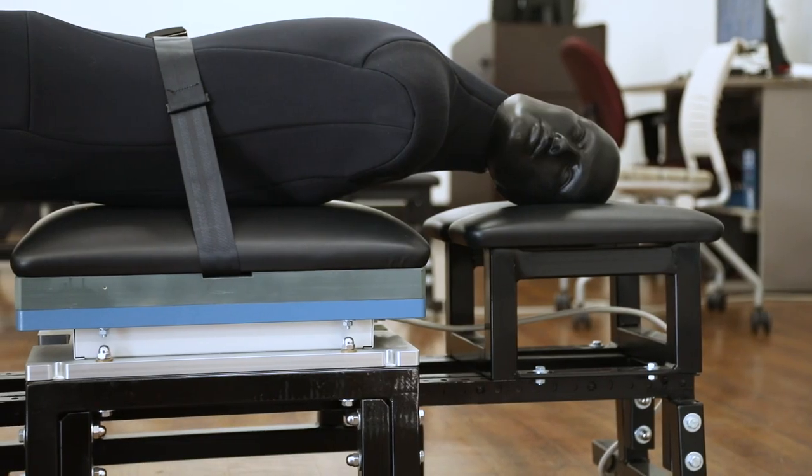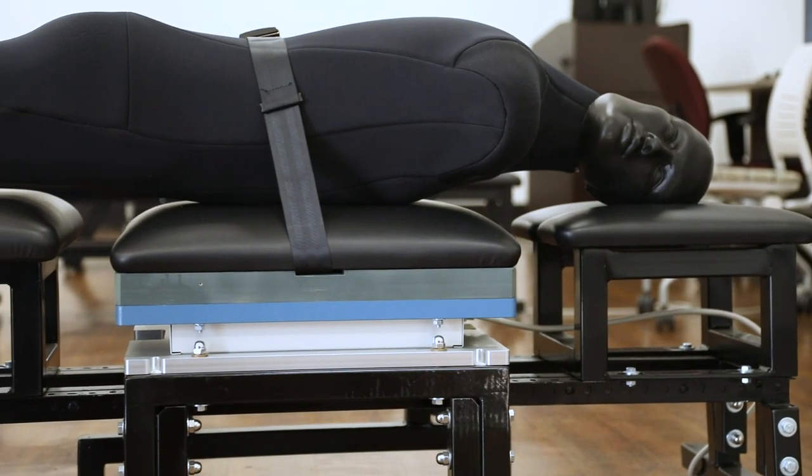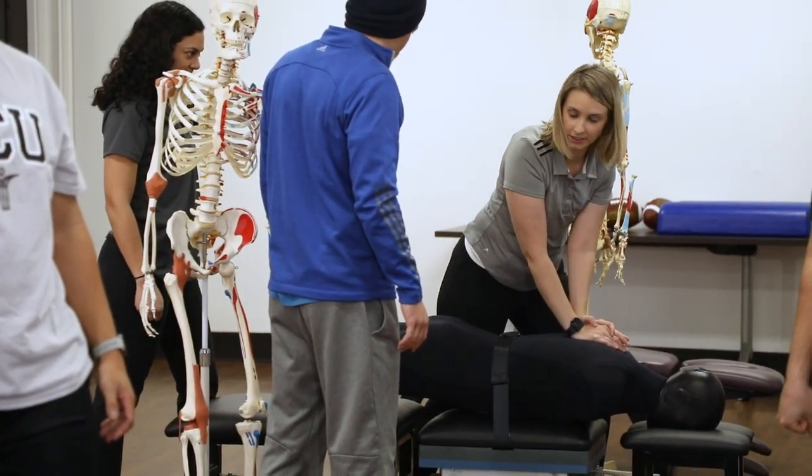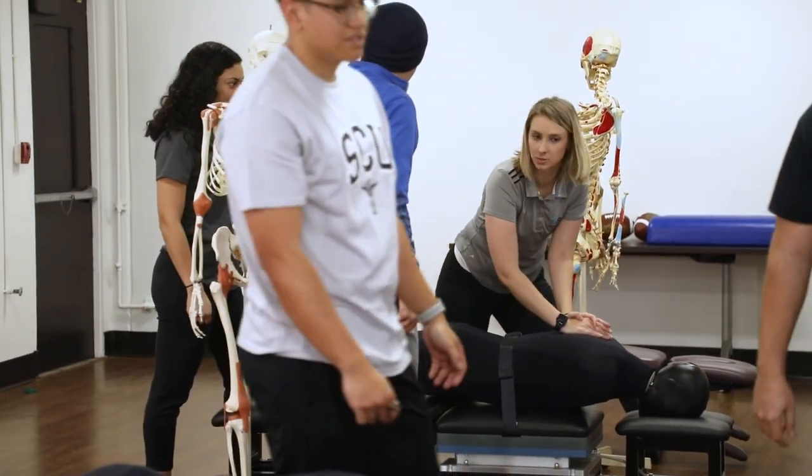Anytime a student is adjusting or palpating and putting any sort of pressure on that table, it's gonna sense it. So whether they are just taking tension or actually thrusting, all of that gets recorded on screen. It gives them objective information versus just subjective — there's no guesswork anymore in terms of the manipulations and the thrusts with the real-time feedback from the force plate.